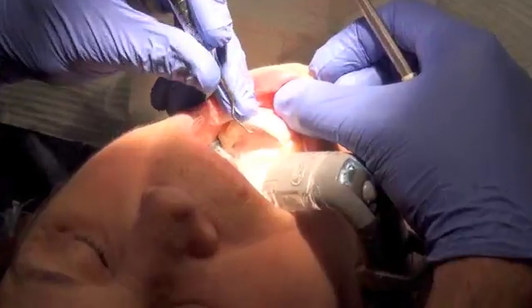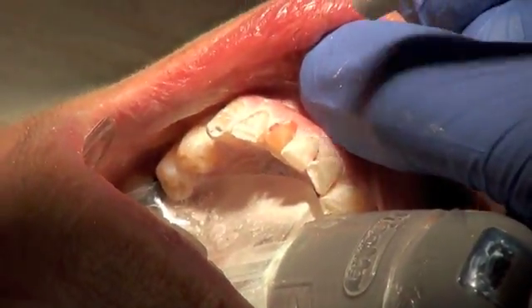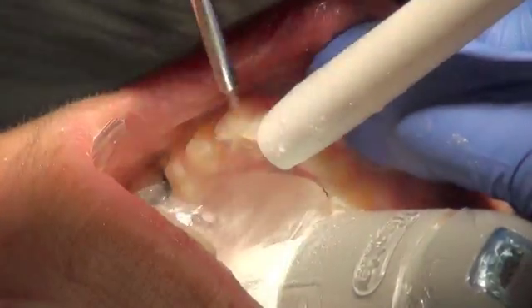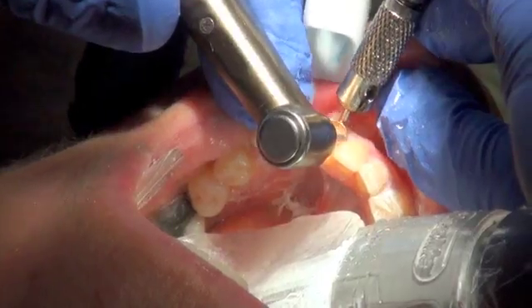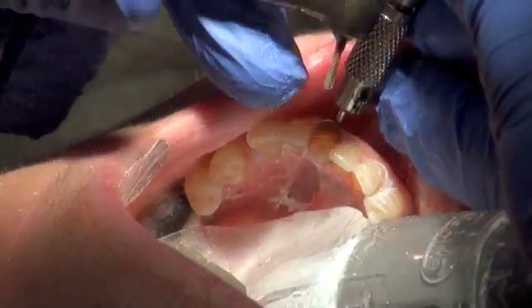Her rough draft was then removed and we proceeded to prepare the tooth to accept the new porcelain veneer. Note the use of the metal retractor that was used to help ensure that the gum tissue surrounding the veneer would not get damaged.